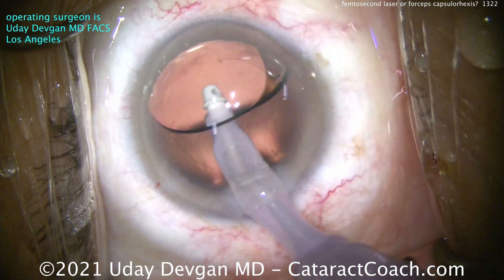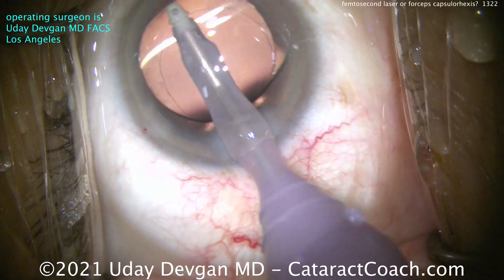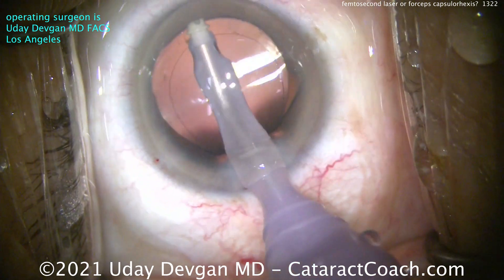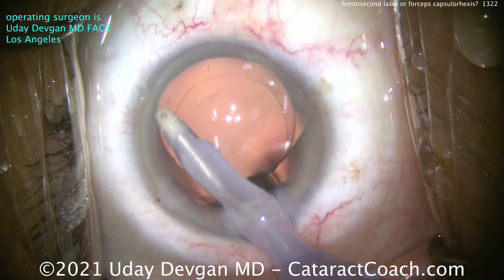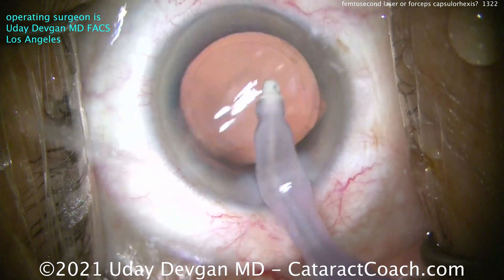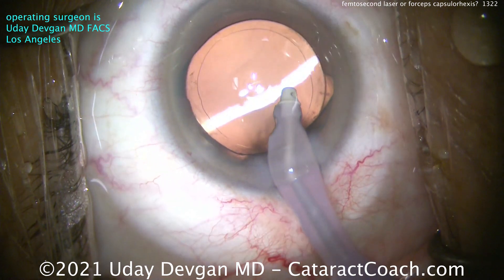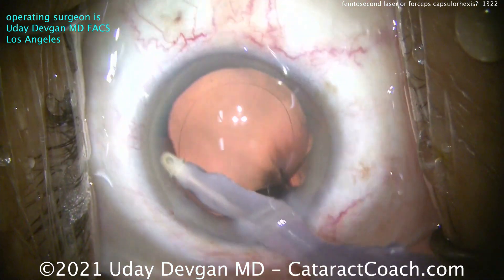So this is a strong, great capsulorrhexis. And one more thing — look at the white conjunctiva there. No subconjunctival hemorrhages, right? There are no subconjunctival hemorrhages because you don't have to apply that suction ring that you do with a femtosecond laser. To couple the femtosecond laser to the eye, you're using a suction ring that can cause subconjunctival hemorrhage. There's that extended depth of focus lens, beautifully centered — the rexis edge overlaps very nicely, and this was just made with forceps.